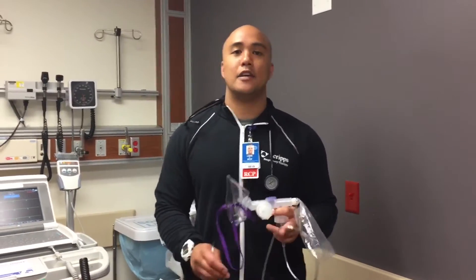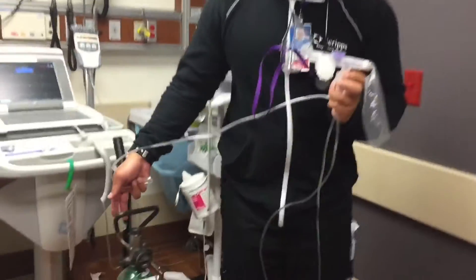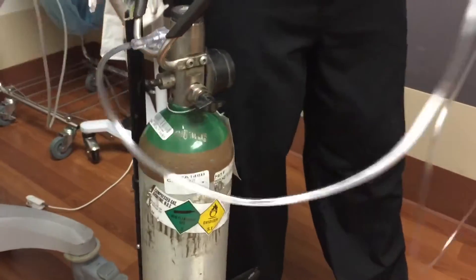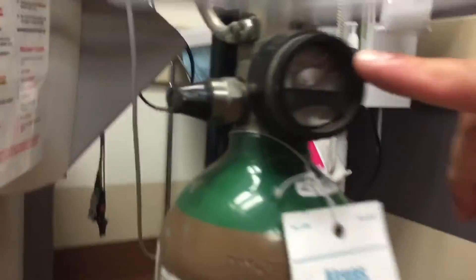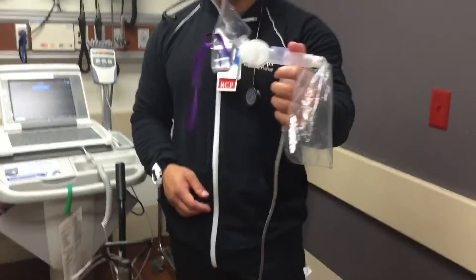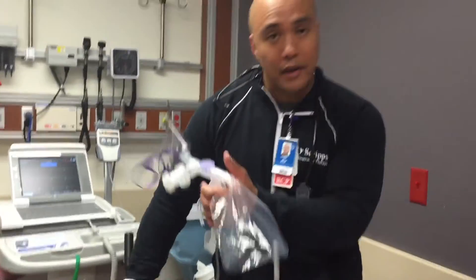Now we'll be discussing how to deliver a nebulizer treatment on an E-cylinder Heliox setup. We'll be using a Circulair II aerosol nebulizer mask in order to hook up to our E-cylinder. We'll be hooking up to this nipple adapter here. Our system is already pressurized because our valve is on and we can see that our psi gauge is reading. So now that we have the system set up, we'll put our medication in the delivery cup and set your flow meter to six to eight liters and deliver the medication to the patient.